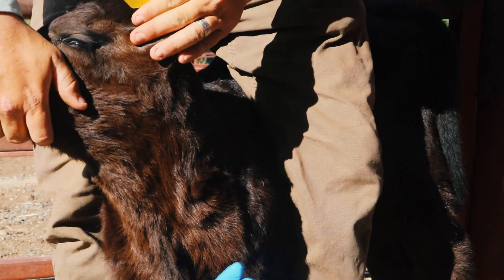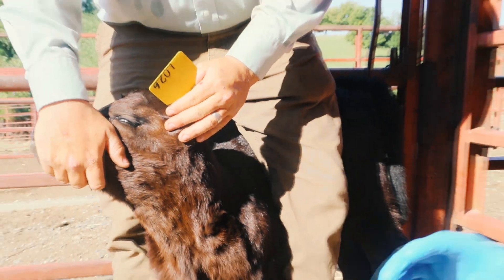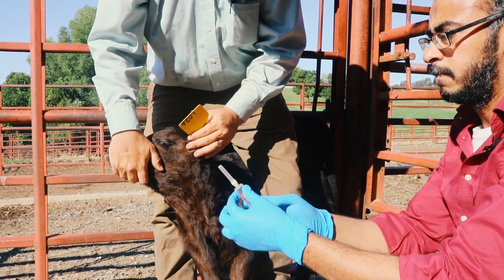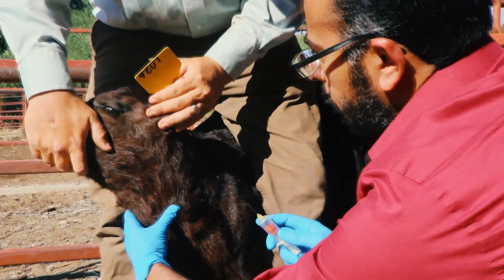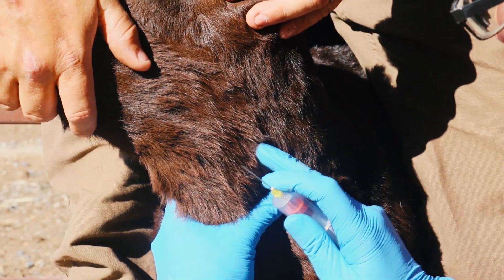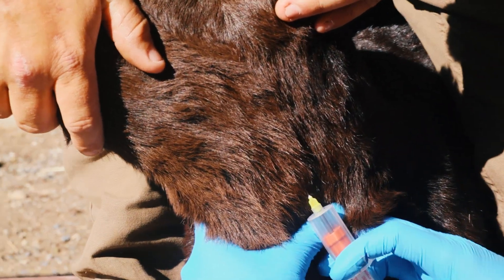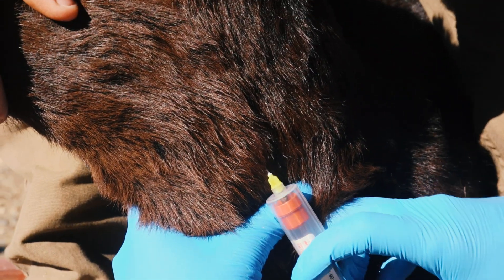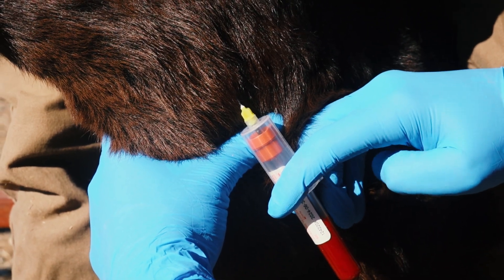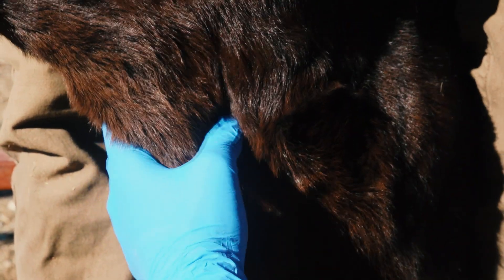Here is another view if you have a helper who can restrain the calf for you. Then you locate the vein by holding off the blood flow. You insert the needle and then push the blood tube onto the needle holder. If you push the tube onto the needle holder outside of the calf, you will lose the vacuum and you won't be able to use that tube any longer.